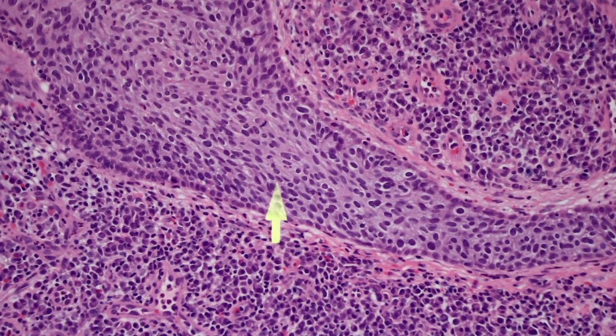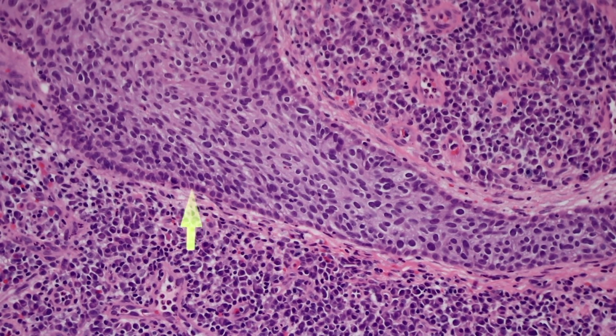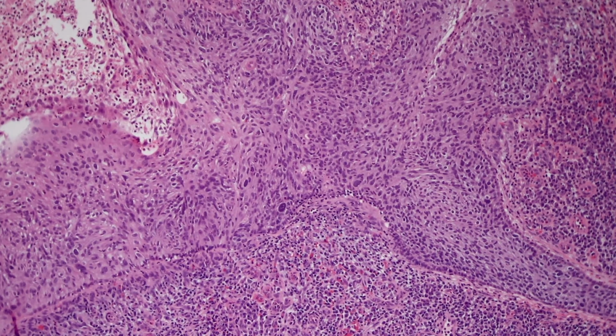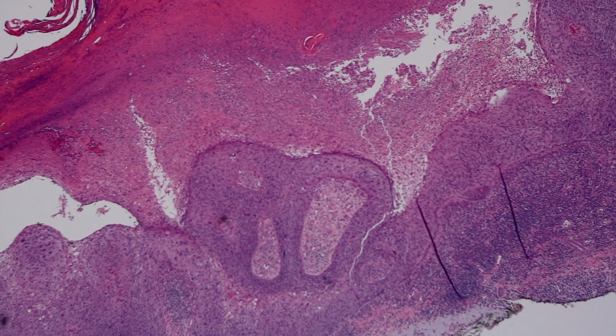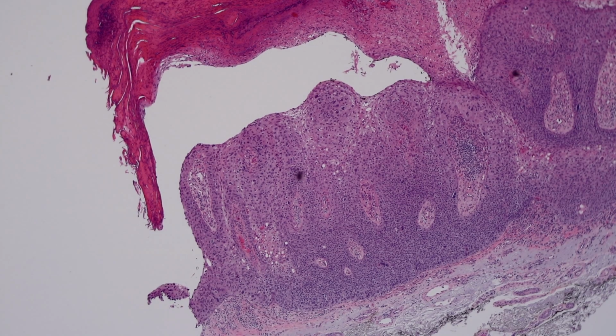You can see the atypical keratinocytes in here with mitoses, but then this little layer of uniform, monotonous, normal basal keratinocytes here. So that's a really helpful clue for squamous cell carcinoma in situ. You tend to not see that eyeliner sign in melanoma in situ. And also, like I said before, melanoma almost never, I mean, there's always exceptions to rules, but almost never do you get full thickness, complete filling of the epidermis with melanoma in situ.